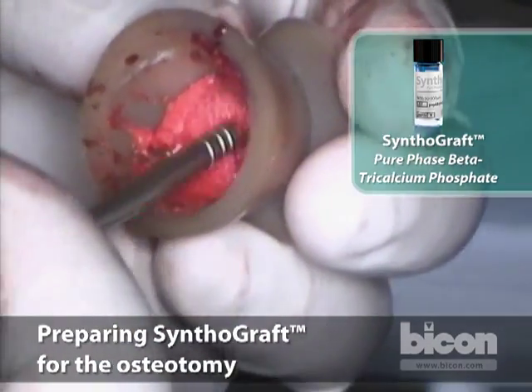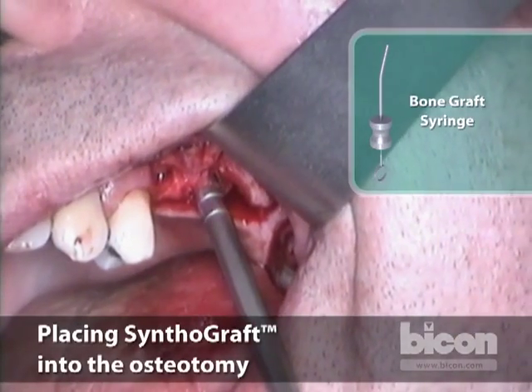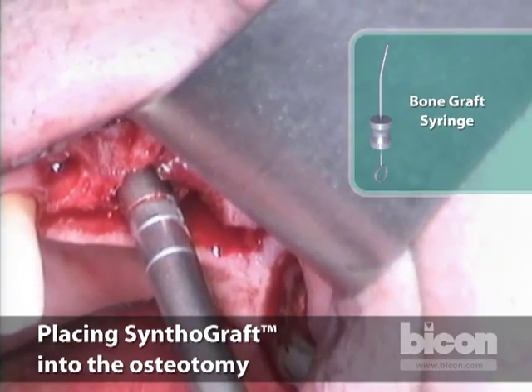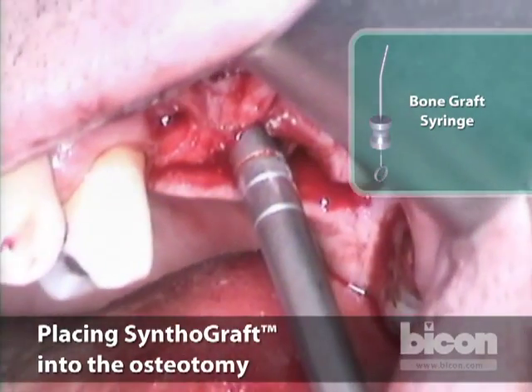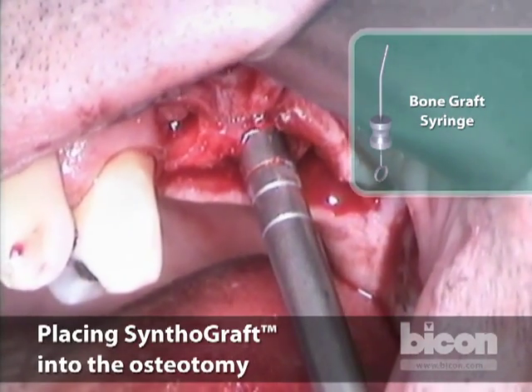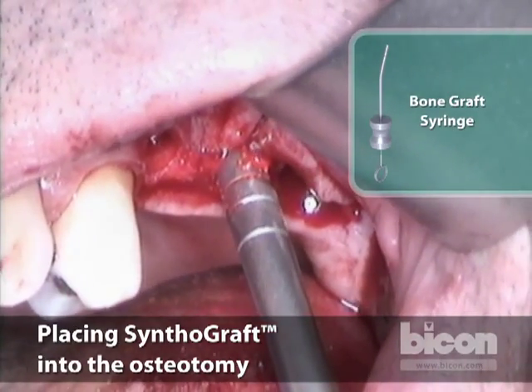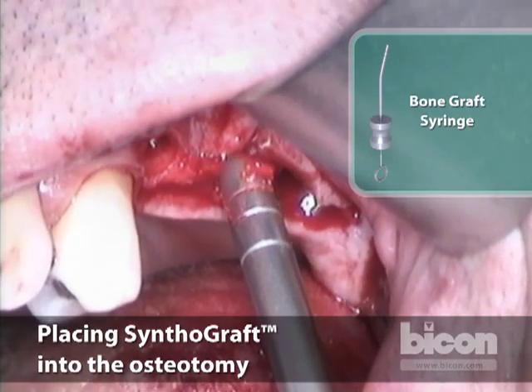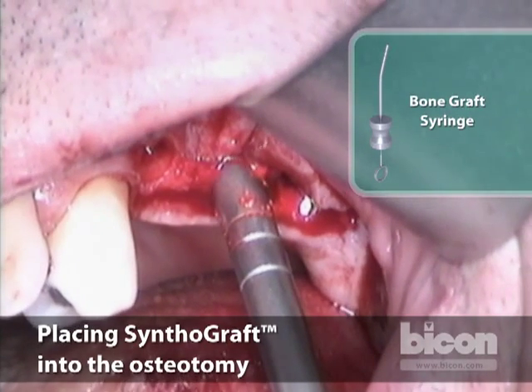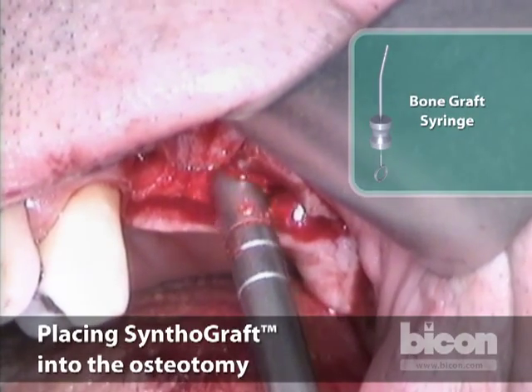We will then use a bone grafting syringe and go in very gingerly, very slowly. We inject the graft ever so deliberately, ever so gently. The idea is to sort of fill the osteotomy and allow this to sneak in and start mobilizing the floor of the sinus. We want to make sure that the graft has gone into the floor.